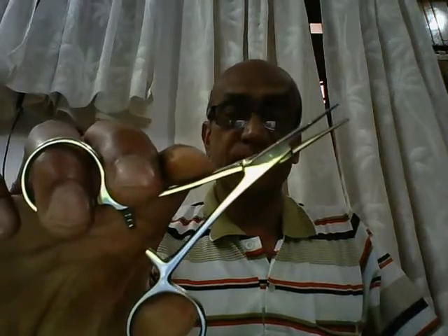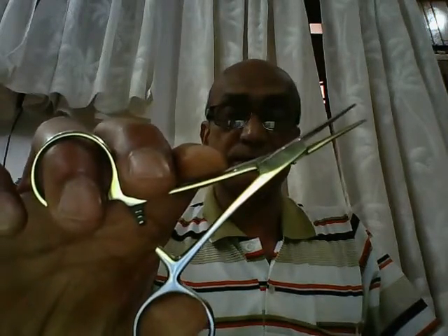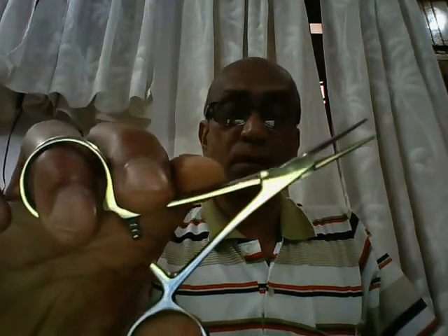Good day, everybody. My name is Dr. Sanjay Sanya, and I'm a surgeon by profession. I shall be demonstrating a few ophthalmic instruments.